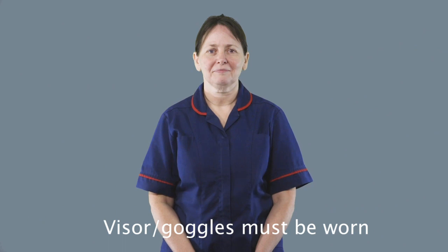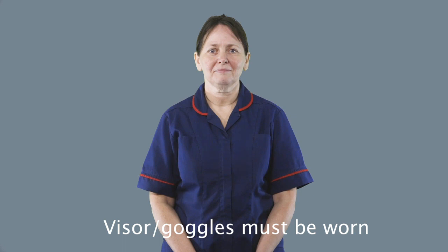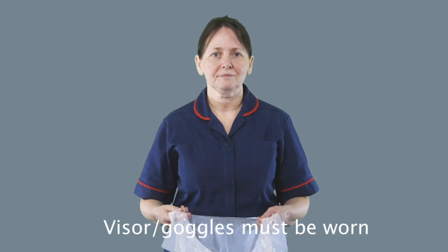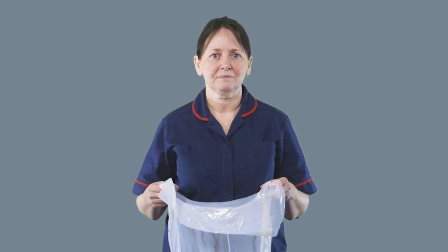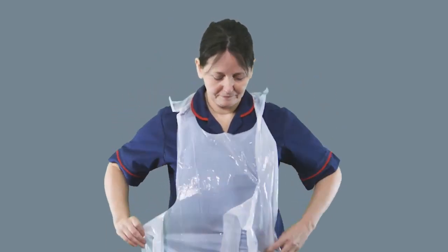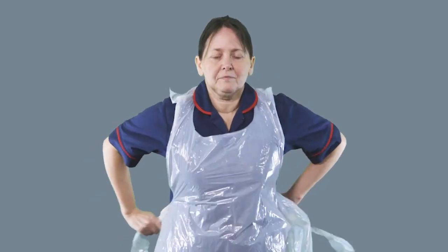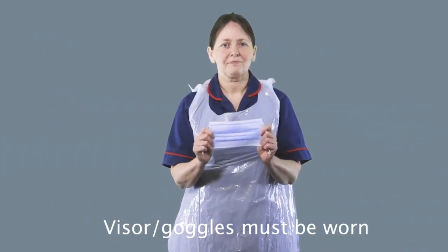Now you're going to put on or don your protective equipment. The first stage is to put on your apron. You want to ensure at all times you're not touching the front of the apron, so try handling it only at the extreme areas or from the inside. Put the apron over your head and then tie the straps behind your back, coming from the inside and tying that round.